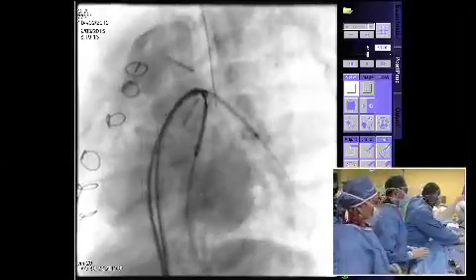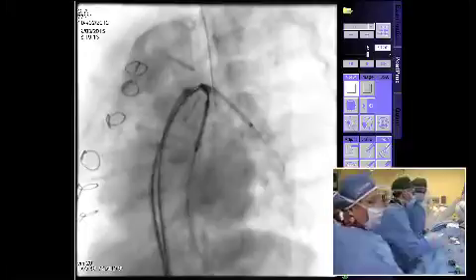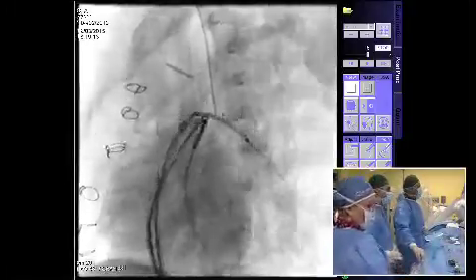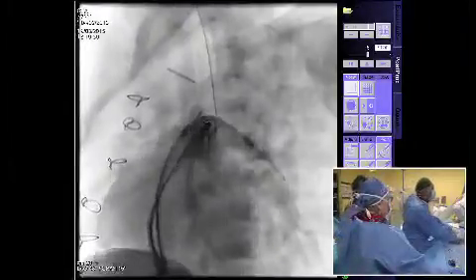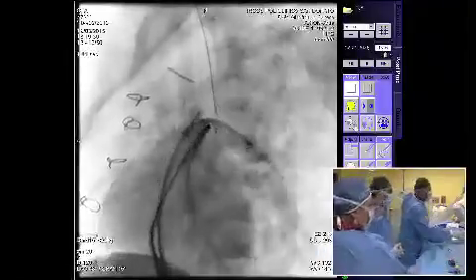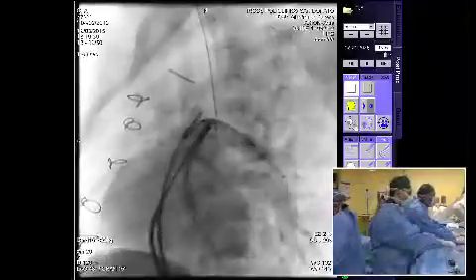So what you're planning now is to put the right stent and then to take again and put the left, or do you want to put them together? I would like again to perform an angio here, please. Ce l'abbiamo? Okay, we should pull back more on the left PA stent, if you agree with that.